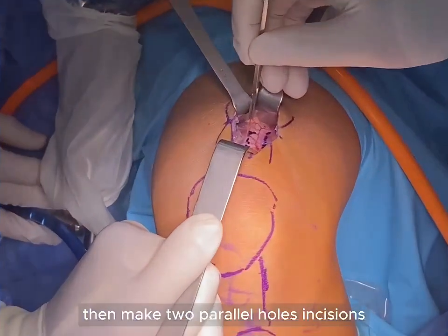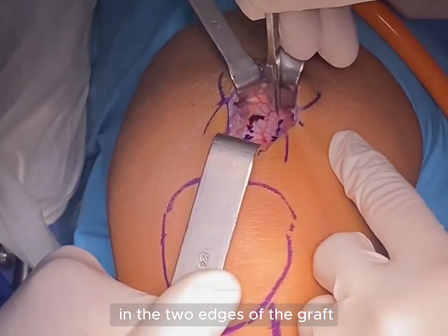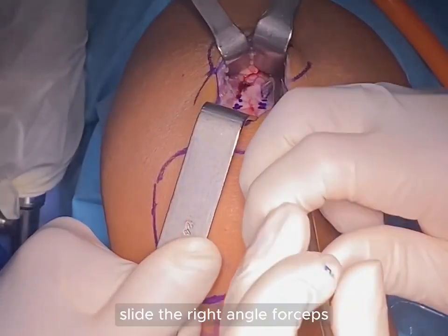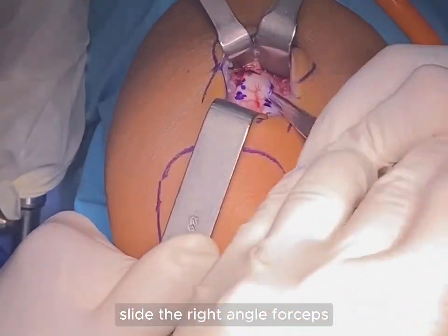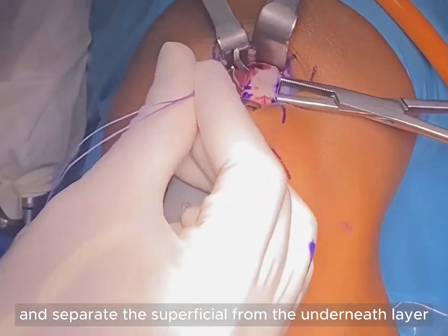Then make two parallel incisions along the two edges of the graft proximal to the fused point. Slide the right-angled forceps and separate the superficial from the underneath layer.